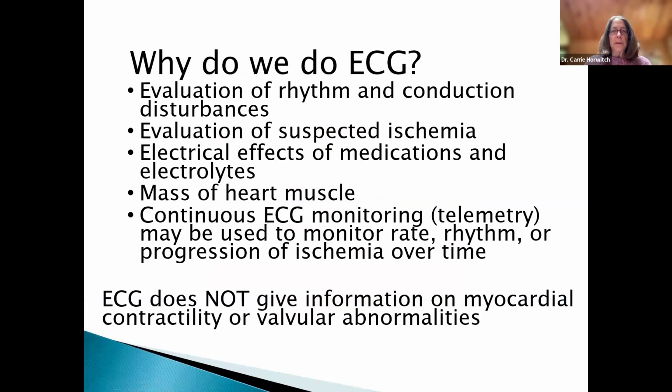So why do we do an EKG? Well, we are doing it to look for predominantly rhythm and conduction disturbances. It is a good measure to try to see if we can find any current findings for ischemia or infarction. We can also see effects of electrolyte abnormalities or medications that may cause abnormalities.